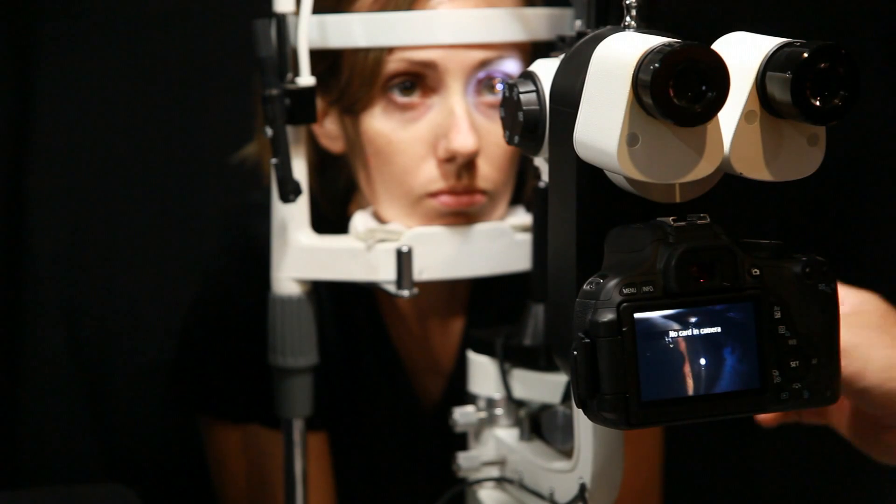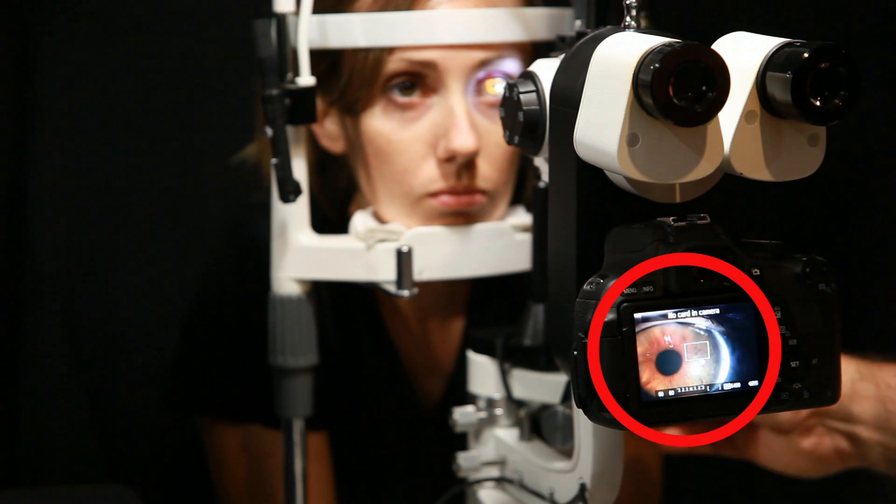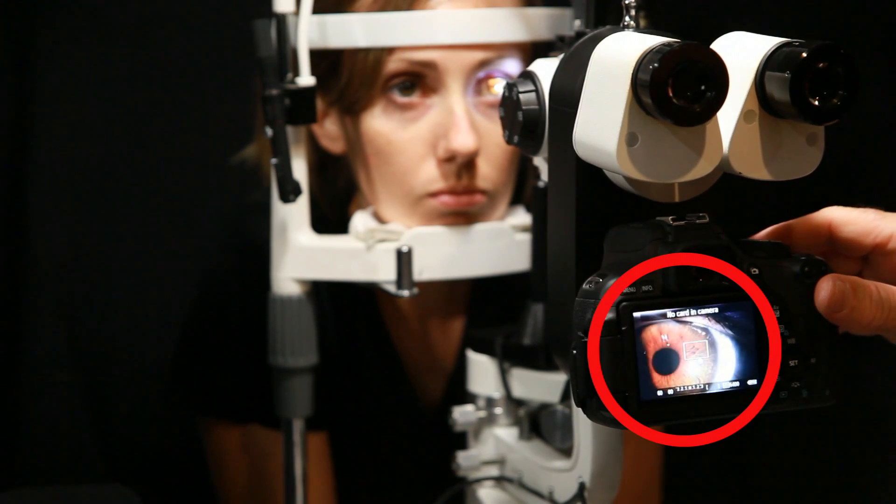Of course, you can focus the slit lamp by looking through the eyepieces, but you can also focus by viewing the live image on the back of the digital camera.